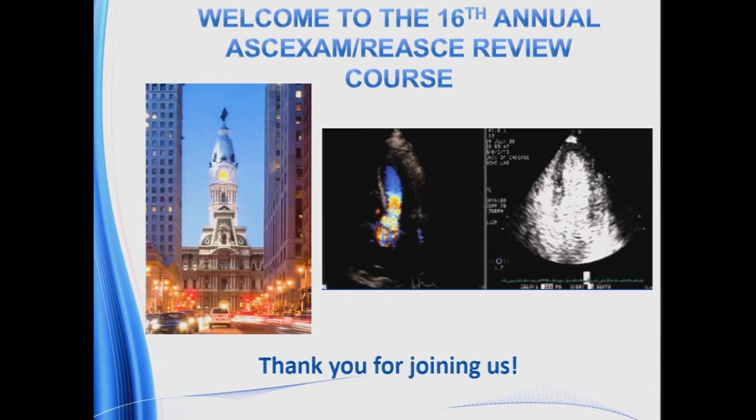And the third question is similar. Leading to leading for the aortic root is confusing. Most centers have been doing trailing to leading. I agree that most centers have been doing trailing to leading for the aortic root.